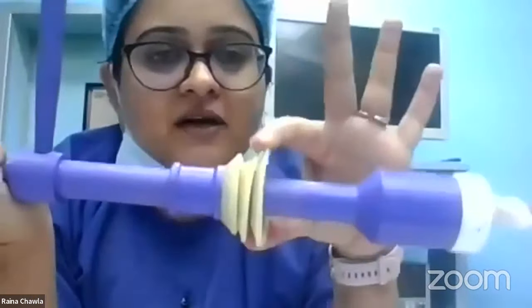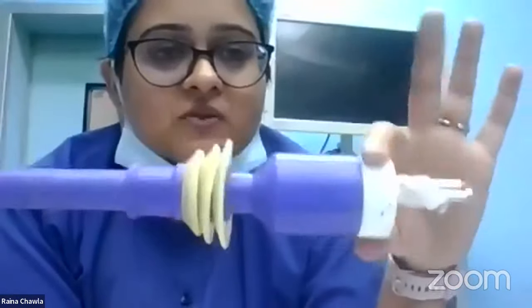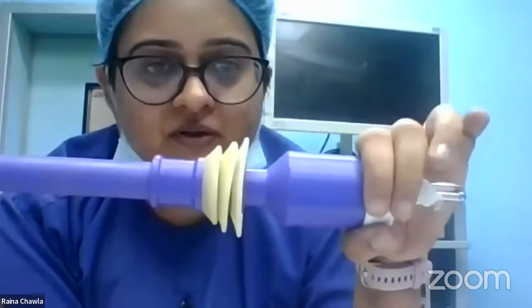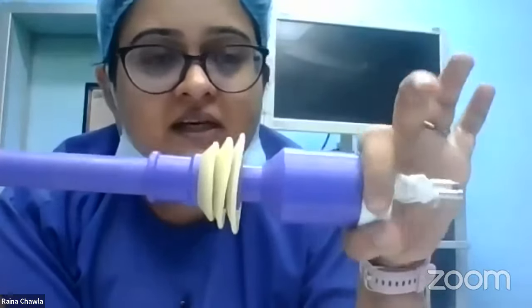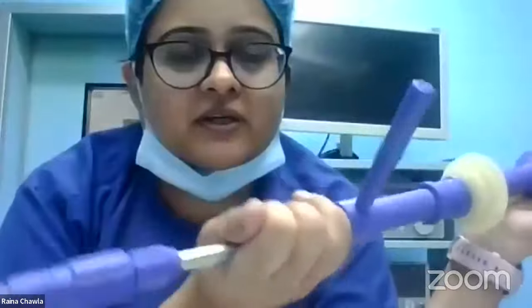This part here prevents gas from leaking. And this white part here helps us define the vaginal vault, that is the lower limit of the cervix, so we can cut the vaginal vault at this point. Okay, so this is a uterine manipulator.